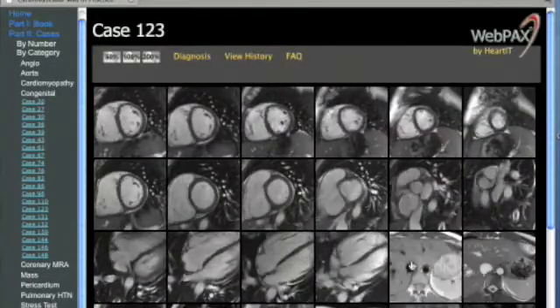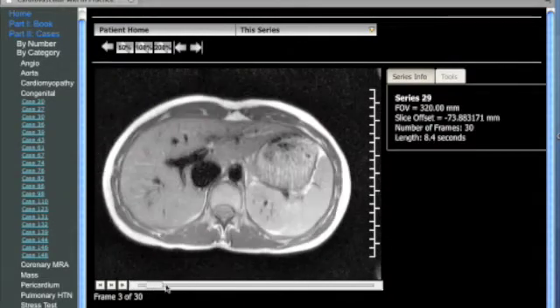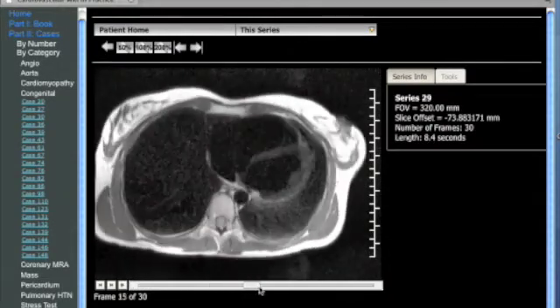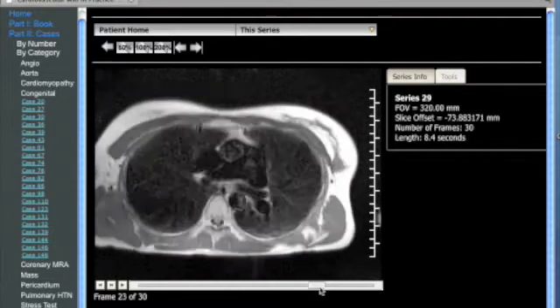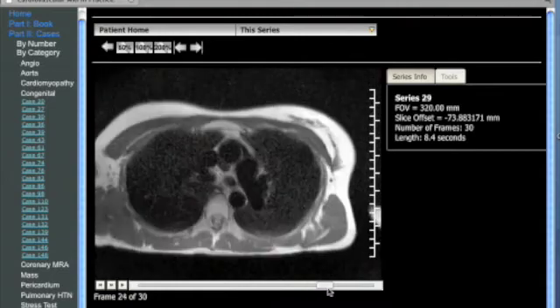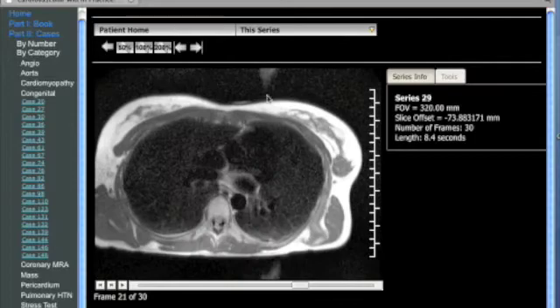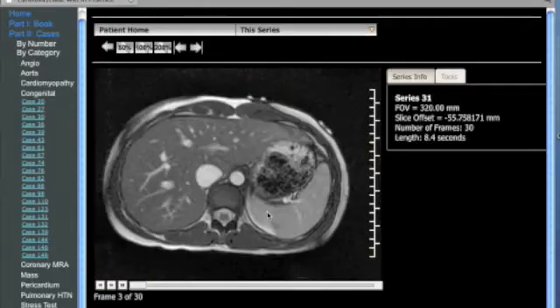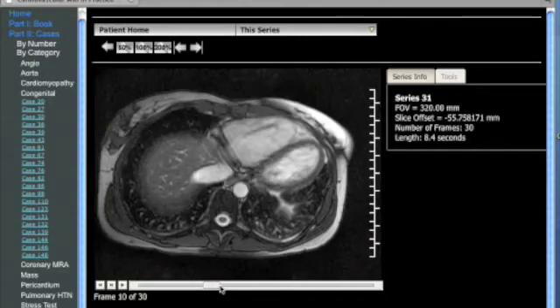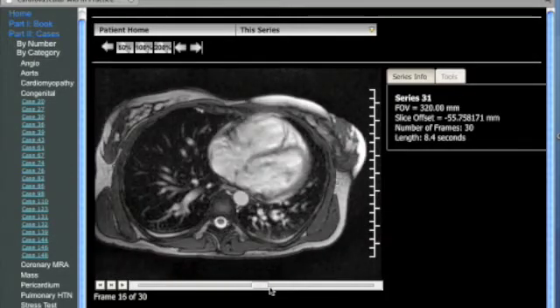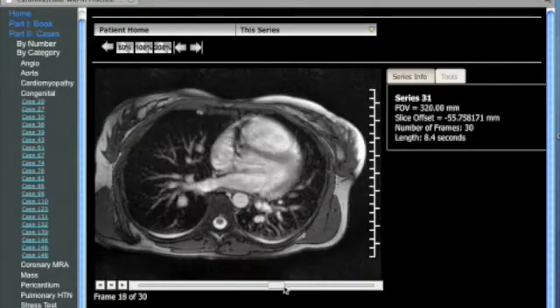Review of the axial phase images, which are dark blood sequences, indicate that predominantly normal cardiac anatomy is noted. On these images, it is difficult to be certain of the insertion of the pulmonary veins, and the bright blood images may be advantageous in demonstrating them. Note the dilatation of the inferior vena cava and the prominence of the right heart structures without evidence of an atrial septal defect on these images.